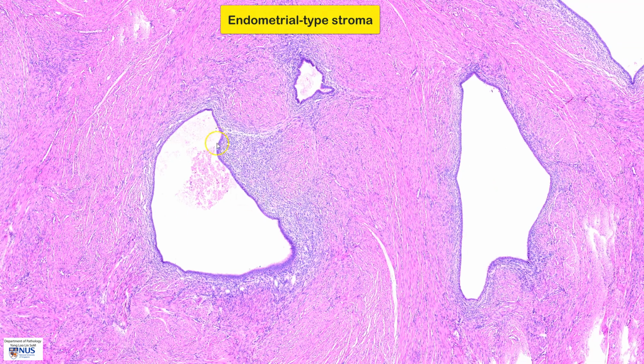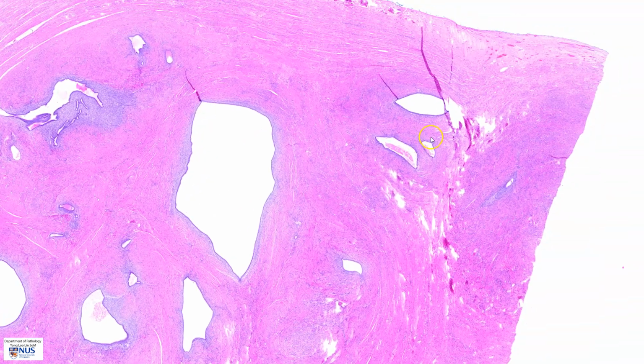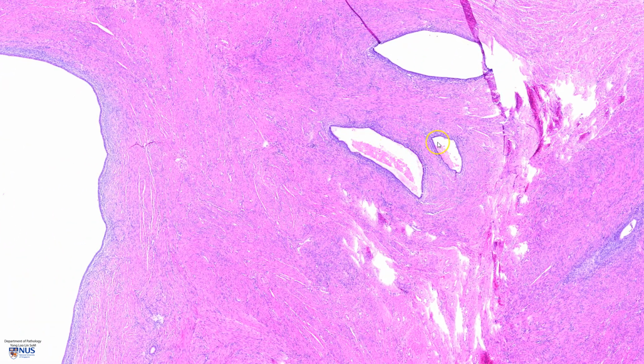So we have endometrial glands and endometrial stroma located within the myometrium, and this is what adenomyosis is. And usually we will see the glands together with the peripheral cuff of stroma in all these foci of adenomyosis. Let's learn a bit more about adenomyosis.